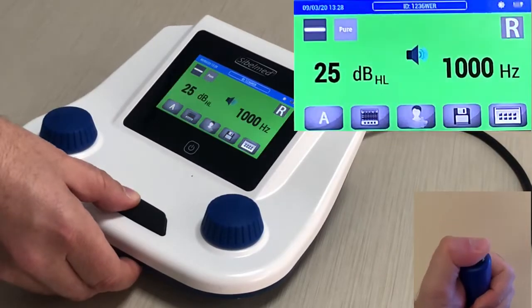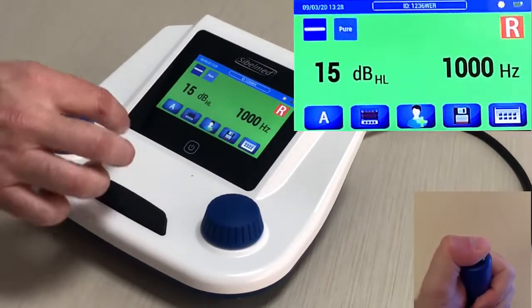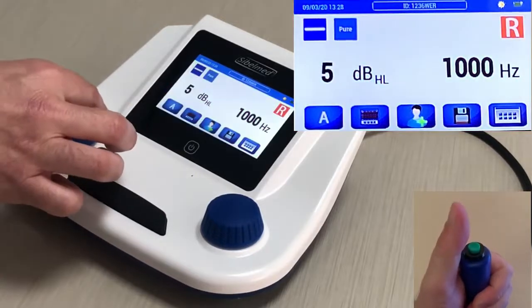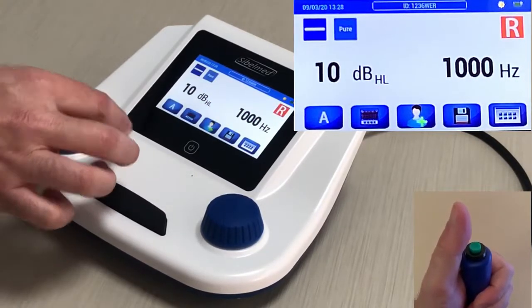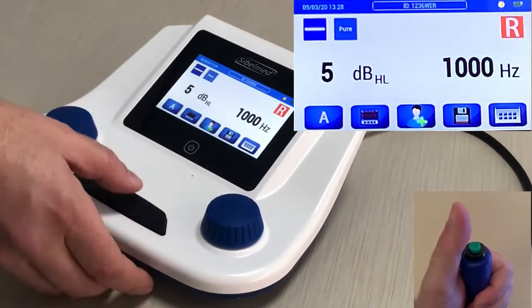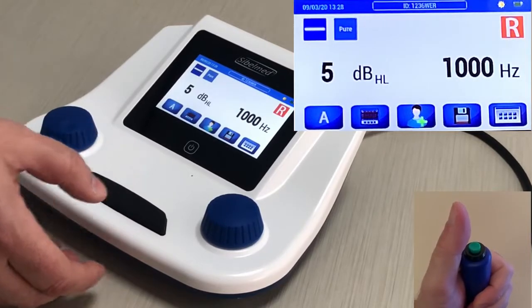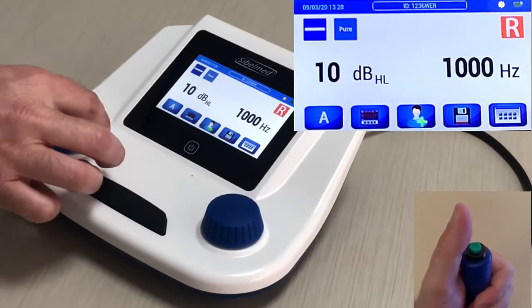We decrease the signal tone step by step until the patient does not respond. We increase the tone step by step until we find the first level heard by the patient. This will be the threshold that we need to save. If the patient presses the button without any signal, then the screen will be lighted up in red.